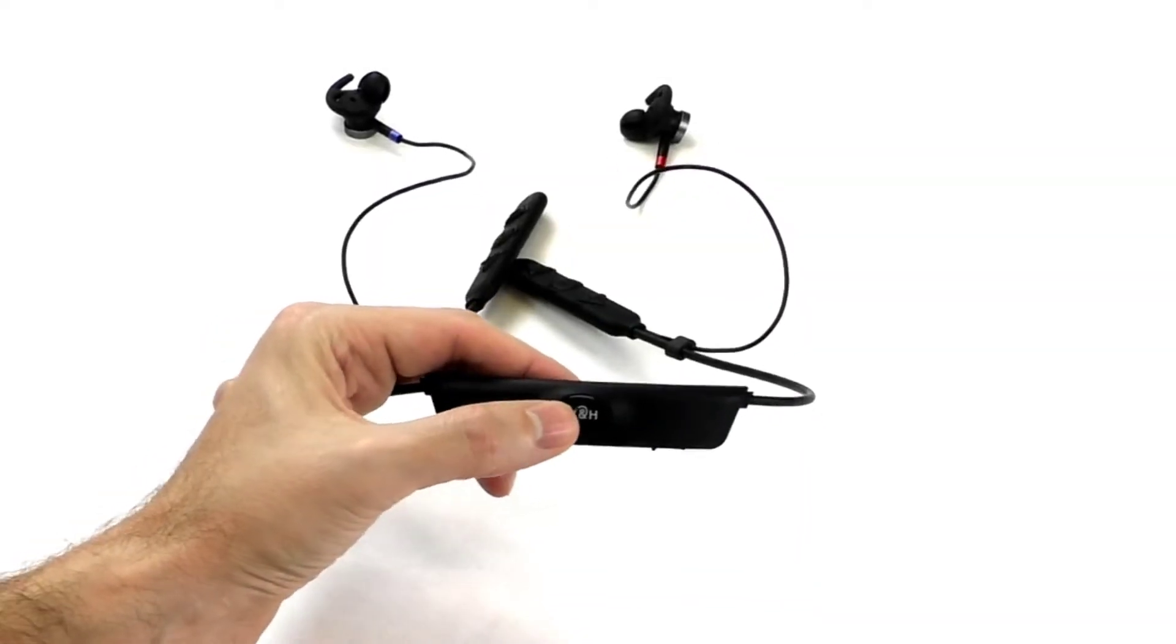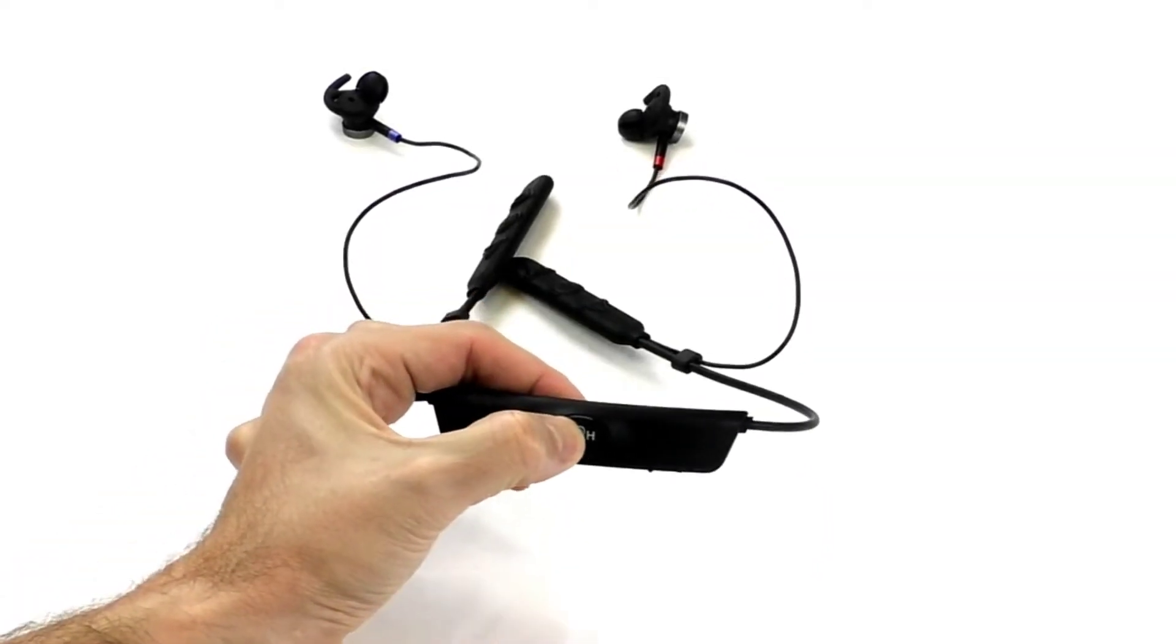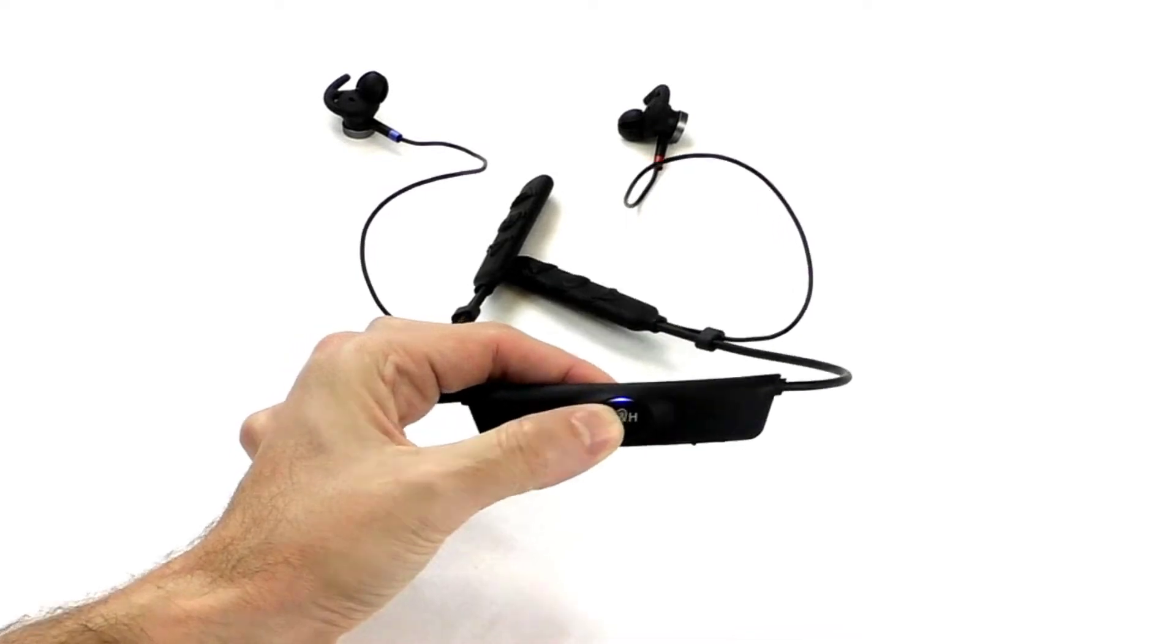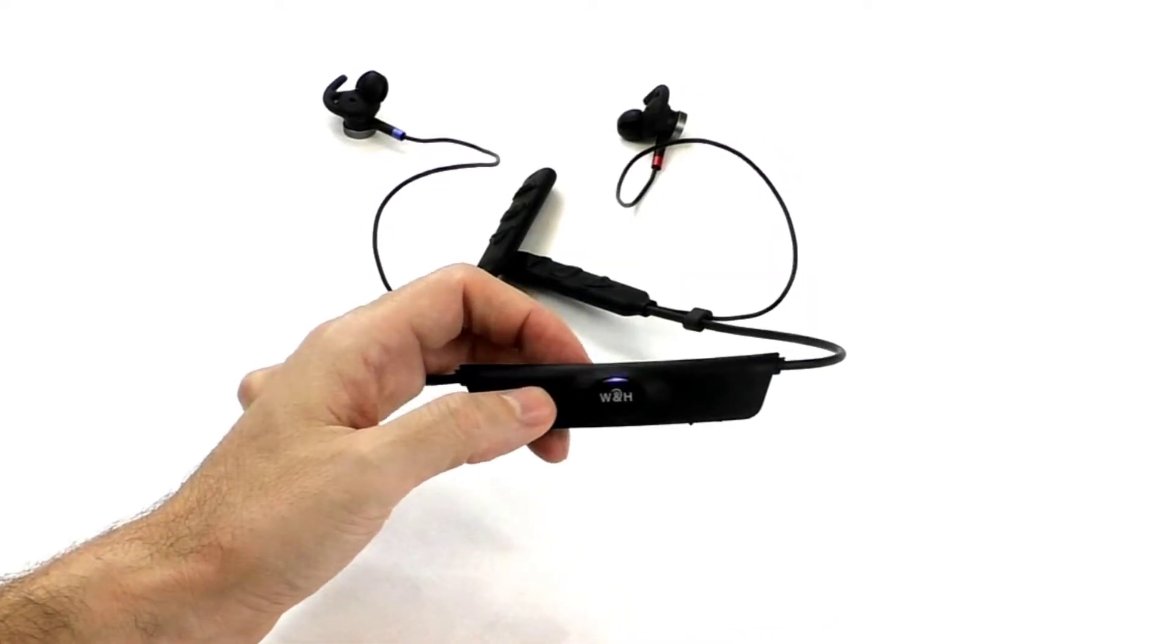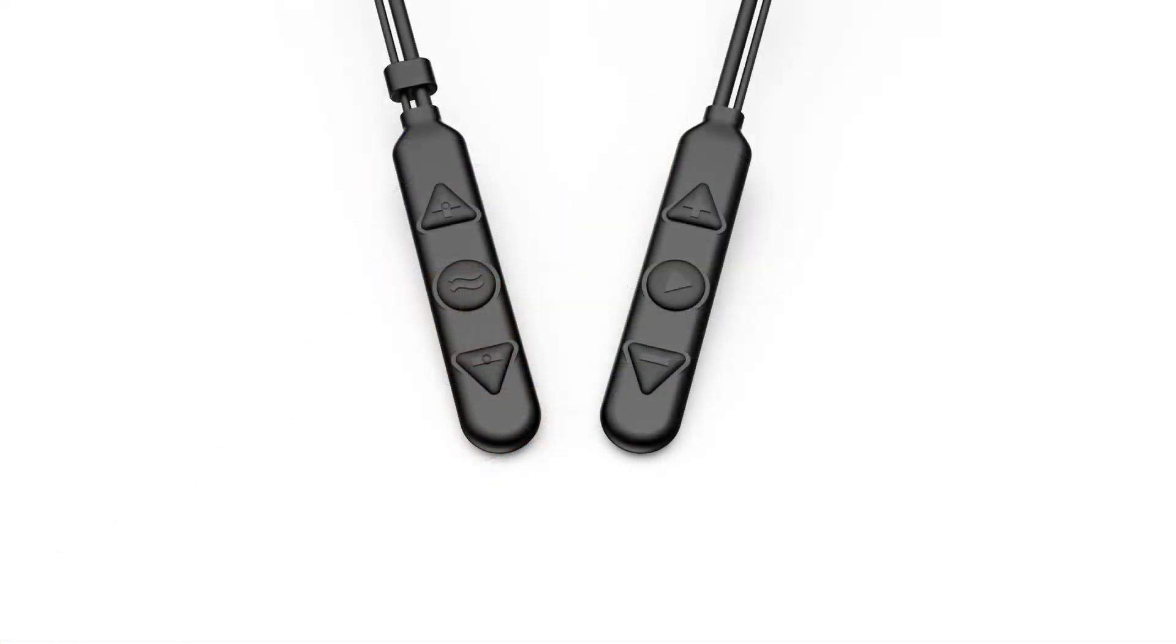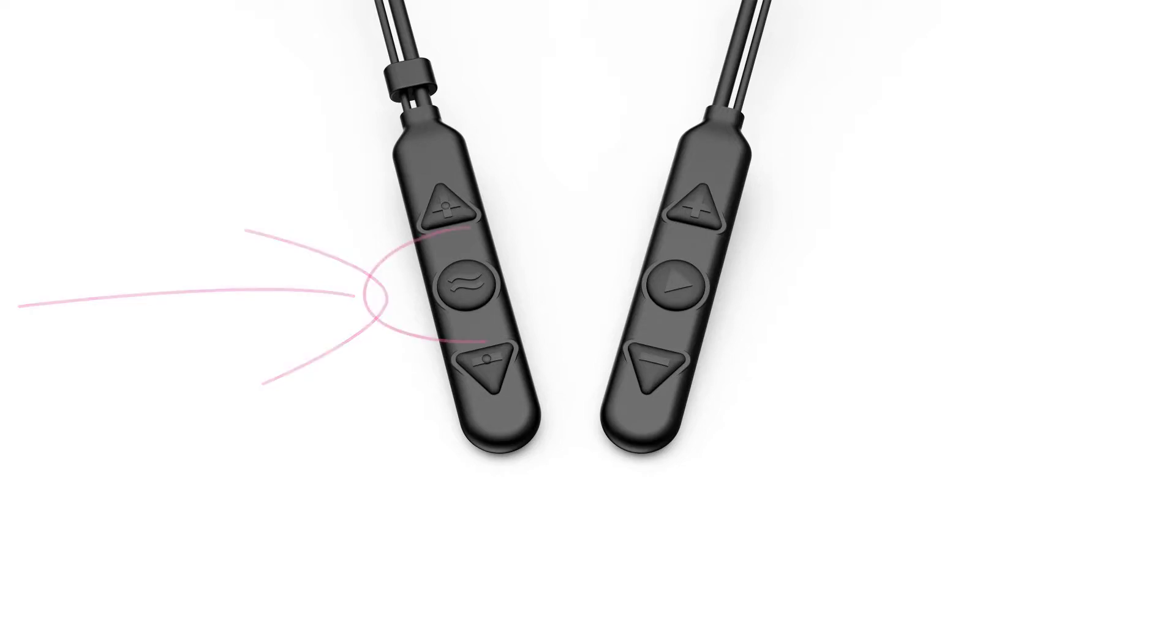Start by turning BeHear on by pressing the power button briefly until the light blue LED appears. To activate personal hearing amplification, toggle the function on with a long press on the right control box's middle button. The voice prompt will indicate the current hearing mode.